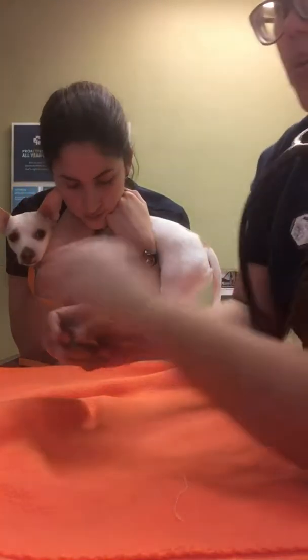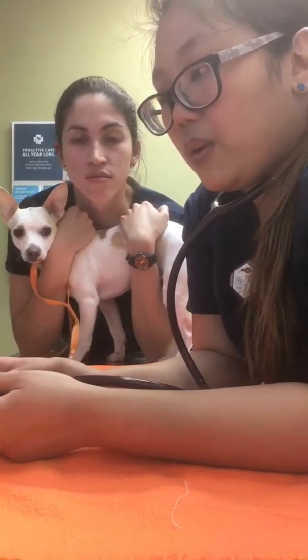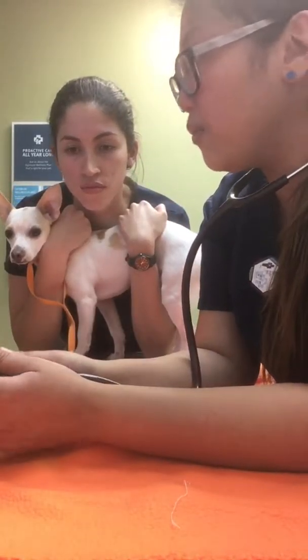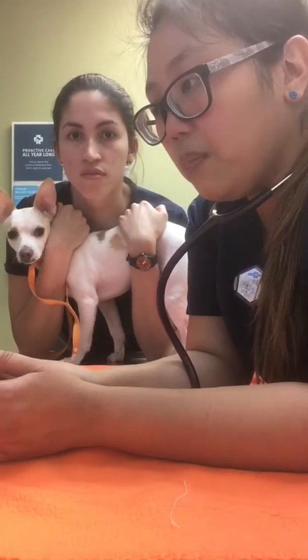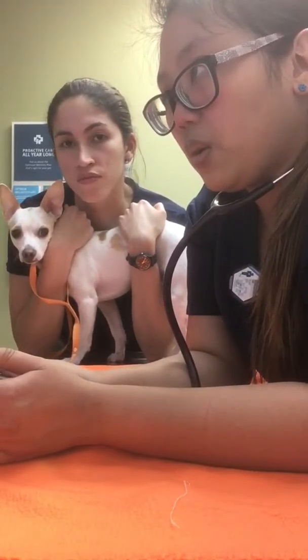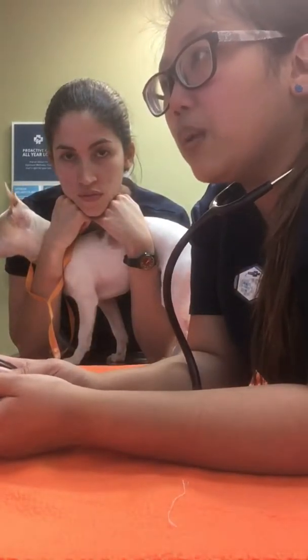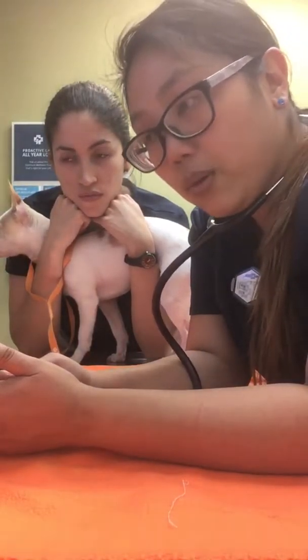So what I would do for the temperature is have Desi, my assistant here, hold Gizmo for me, and we're going to perform a rectal temp. Usually the normal range is between 99 to at least 102.3. Anything above 102.3 would be considered a fever.